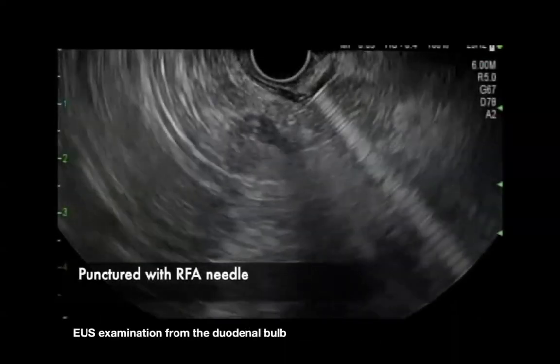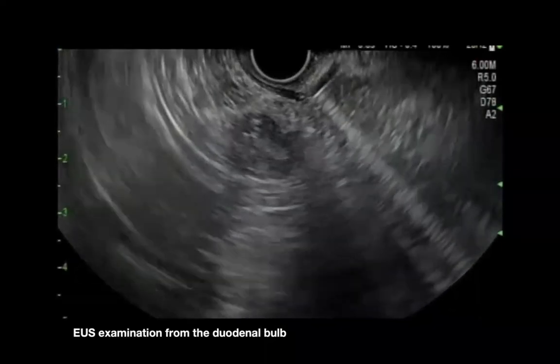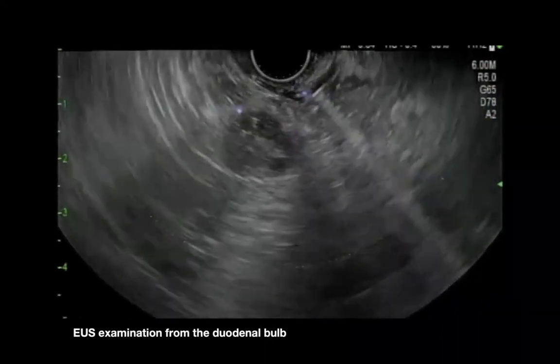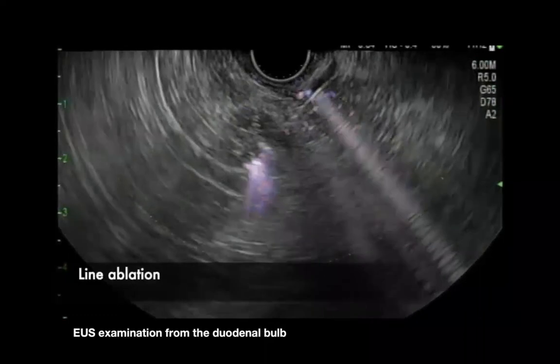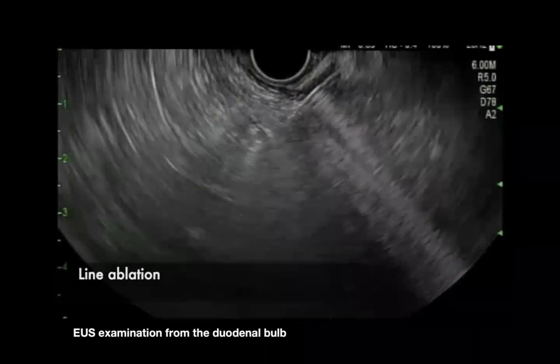In a similar fashion, the hypoechoic lesion was punctured with an RFA needle. The needle is usually advanced towards the distalmost part of the tumor and gradually pulled in a linear fashion proximally while the ablation is being carried out. In this fashion, a line ablation is carried out.